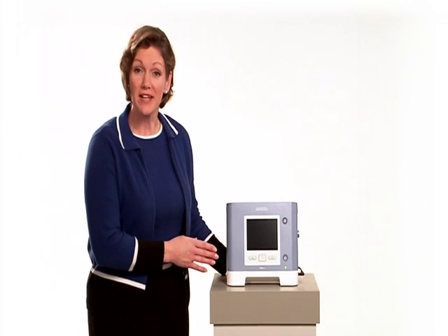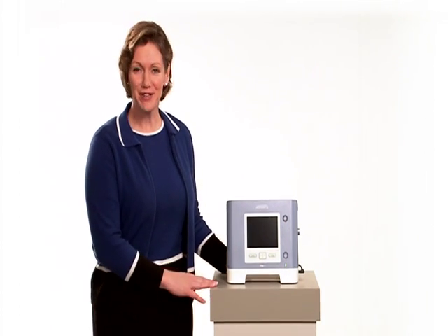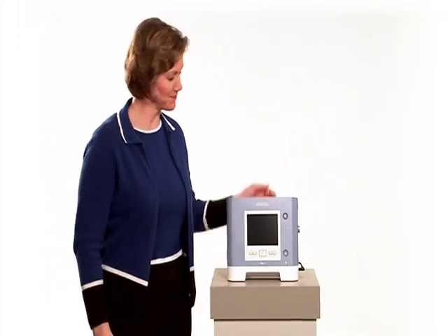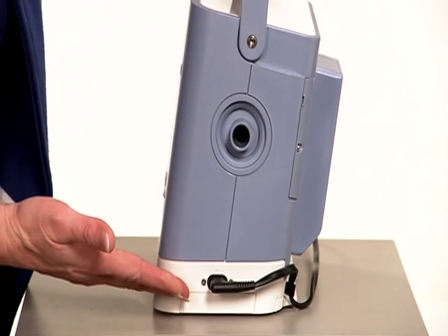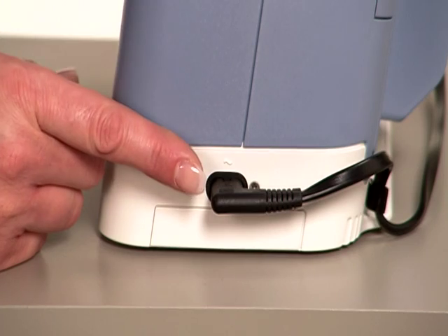The display screen serves as the information hub for Trilogy100. Here you can view settings, select options, and view alarm indicators. On the right side of the unit, you can see the AC power inlet. When you plug the ventilator in, the socket end of the cord connects here.